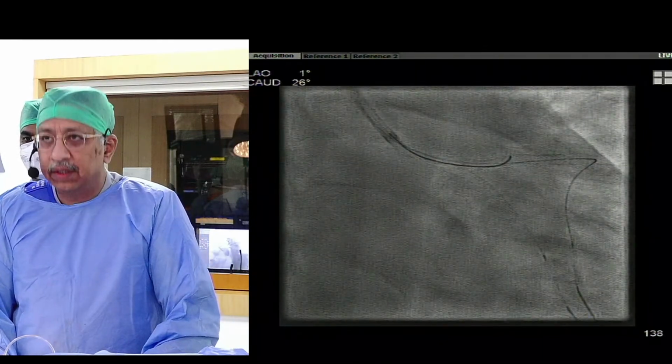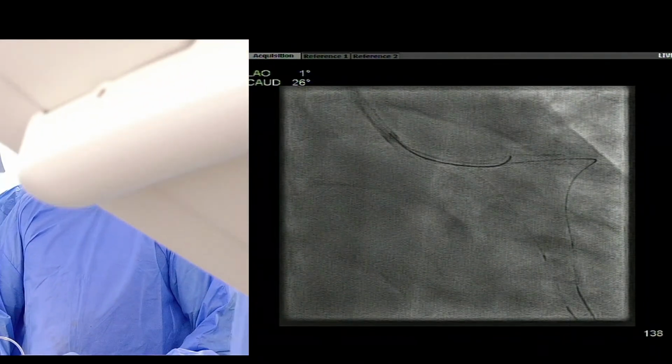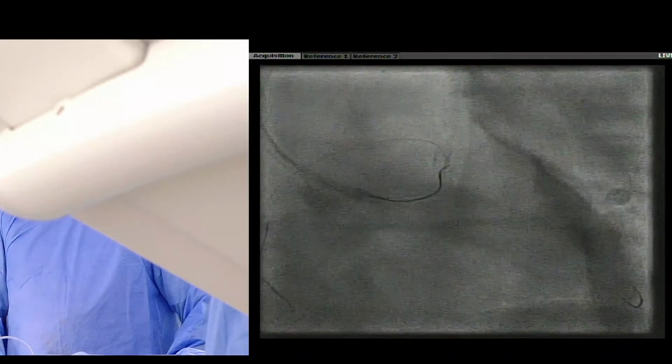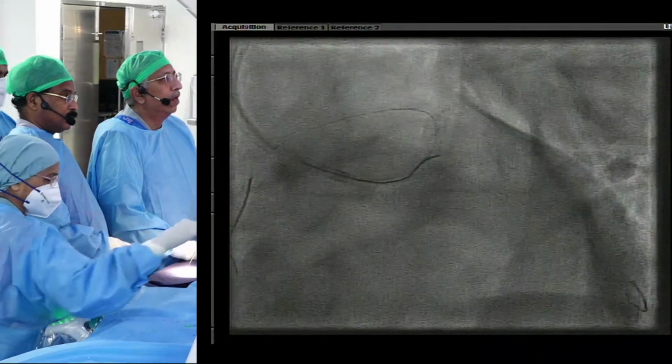So you have an iFR wire, Ronnie. What about stenting across, doing an iFR, and if it's completely normal, does that help guide you or not based on this?